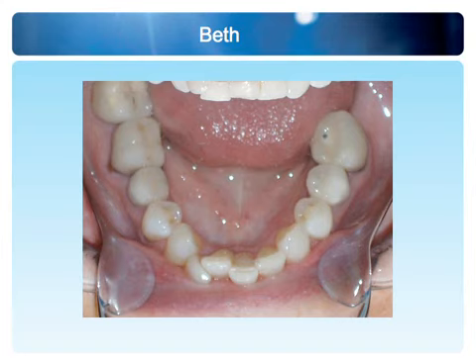Looking at what's going on back here, these are leaning in. These molars are leaning in so far you can read the whole buccal surface all the way to the recession. And that's not where the alveolar housing is. We could tip these teeth up, and as the anterior teeth expand, it gives you room back because you upright or expand those lower teeth. Number 1. You get more arch length all the way around to fit these teeth in. Number 2. You improve the buccolingual inclination.